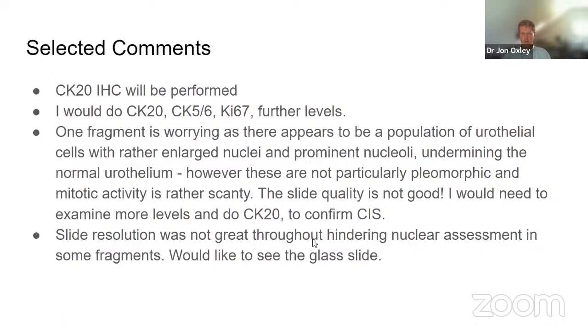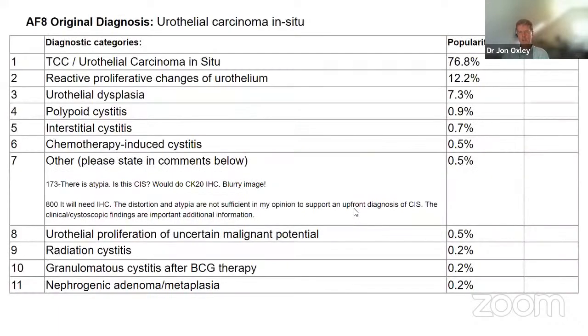And although the slide resolution was not great, I did show you an area where there were 5 nucleoli in one nucleus. I agree that in one piece it was not brilliant, but it was pretty good in another area, which was the area of interest. And this is the scoring.